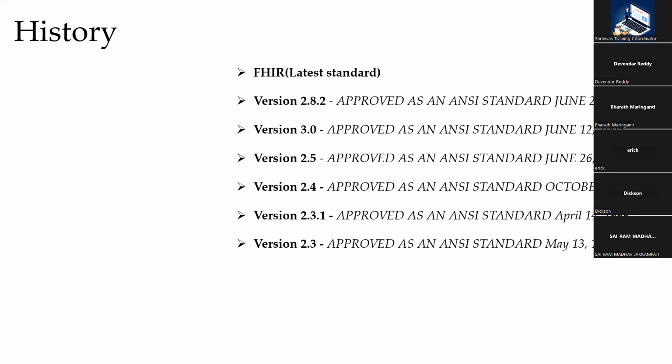One of the reasons is they changed the entire structure of the HL7 message. So in version 3, you are not seeing the traditional structure anymore. You are seeing a different XML-related architecture or design, which is completely different from the current model of version 2. That is one reason which made it difficult to get the talent who can implement interfaces using V3, version 3. That's primary.